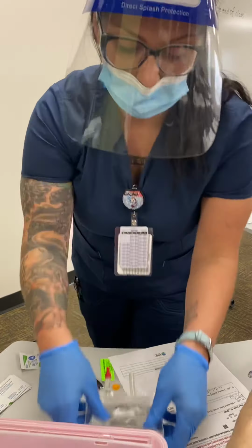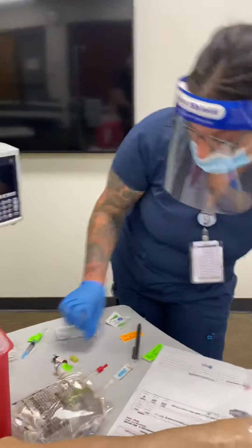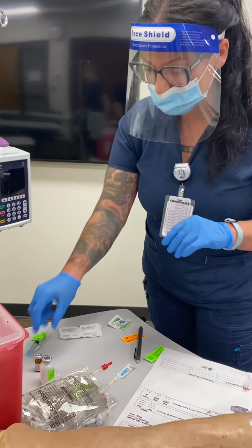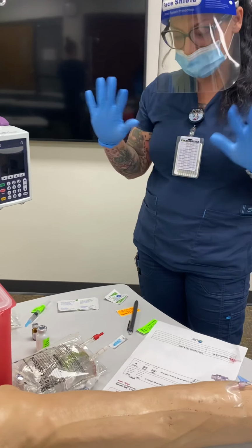All right, so everything's good. You don't want to mix that too hard, to keep it from forming air bubbles. All right, so everything has been prepared. I'm going to go ahead and go to the patient's room. I would bring my morphine with me, change my gloves, wash my hands.